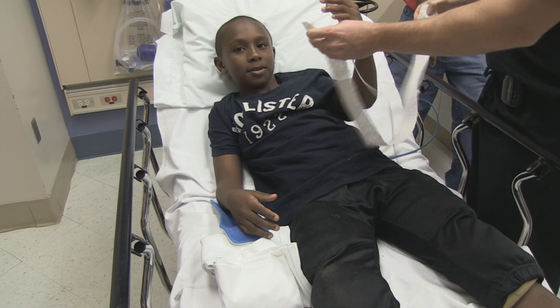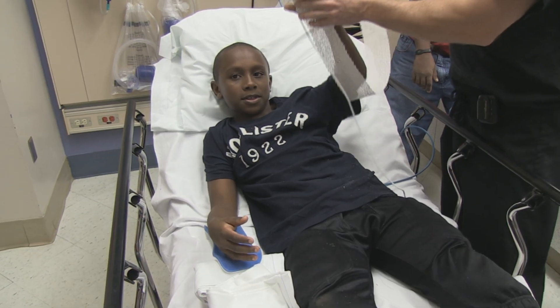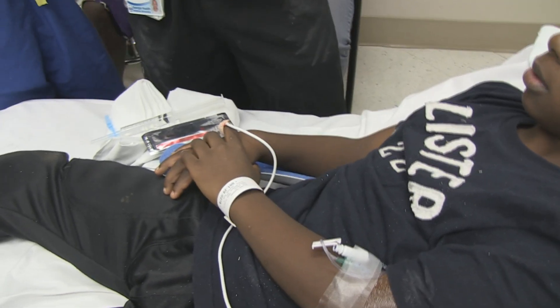You fell on your hand like that, or how'd you fall? I fell on my wrist. On your wrist? It's just going to be a little bee sting, okay?